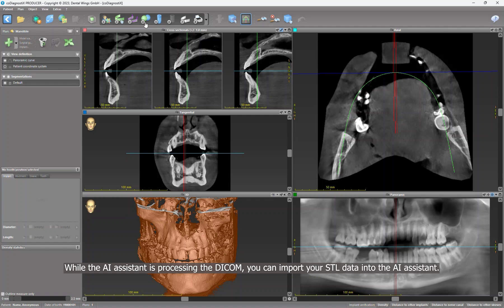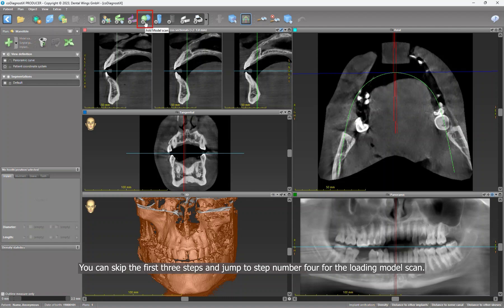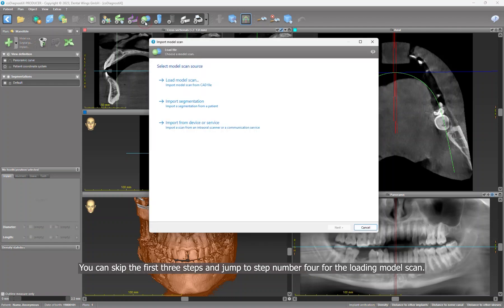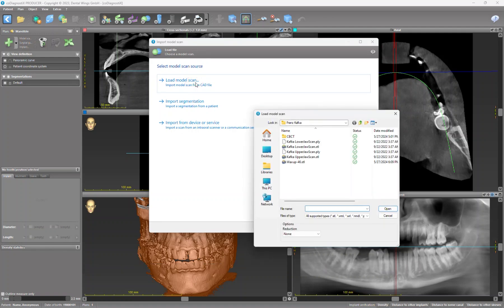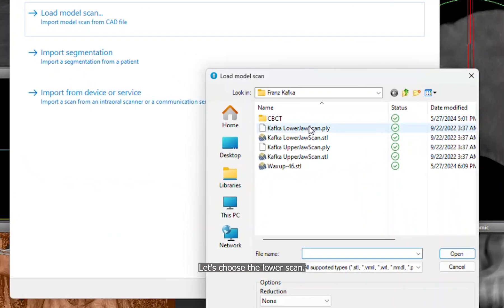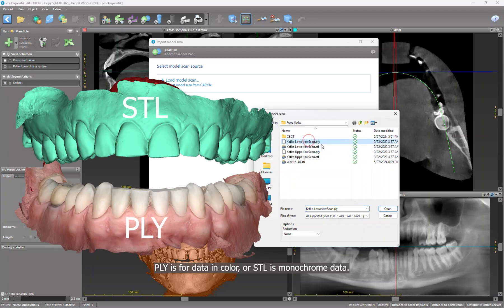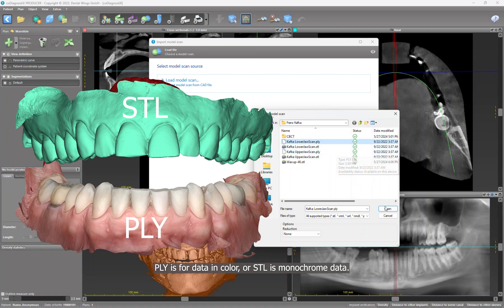Into the AI assistant, you can skip the first three steps and jump to step number four for the loading model scan. Let's choose the lower scan. You can import PLY and STL data. PLY is for data in color or STL is monochrome data.